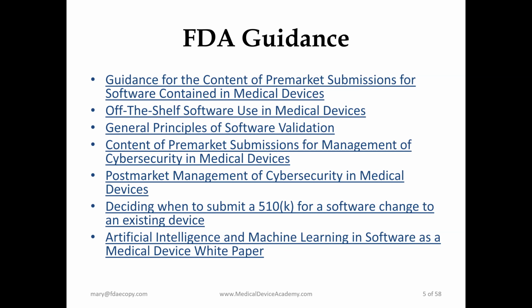Deciding when to submit a 510K for a software change to an existing device is a supplement to the guidance for evaluating changes for a new 510K. And then finally, that last link on there is to the Artificial Intelligence and Machine Learning and Software as a Medical Device white paper. And that is not necessarily a guidance. It is just the FDA putting their thoughts out there and wanting to get some feedback. But that kind of goes over a high level where we might be headed with regard to AI software in medical devices. Next slide.